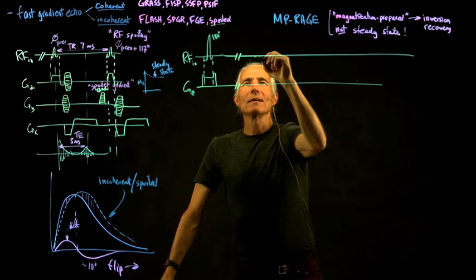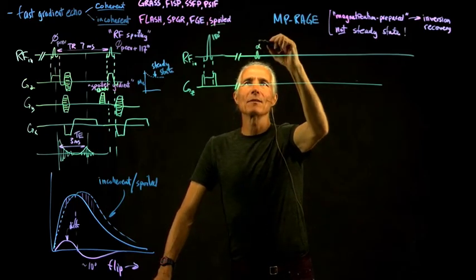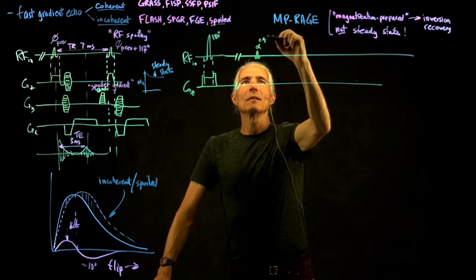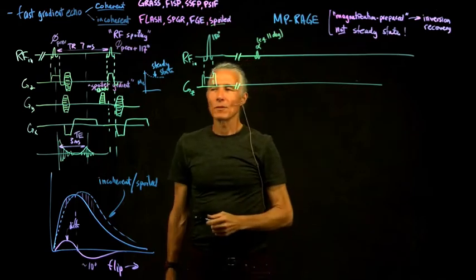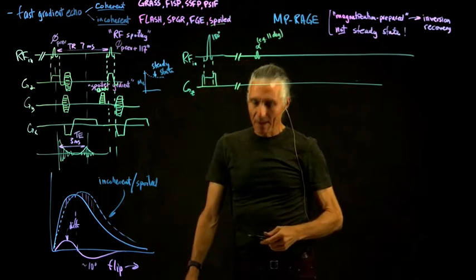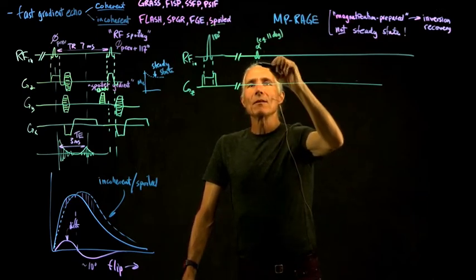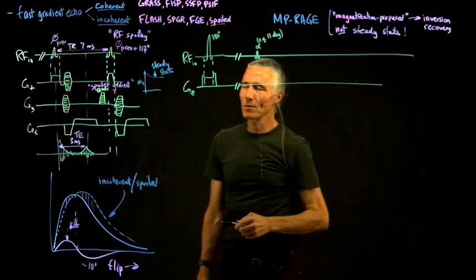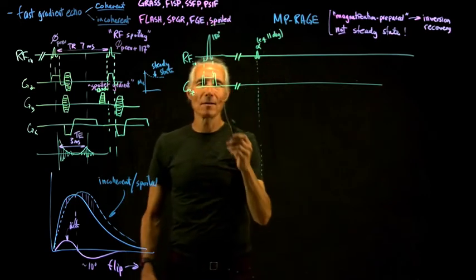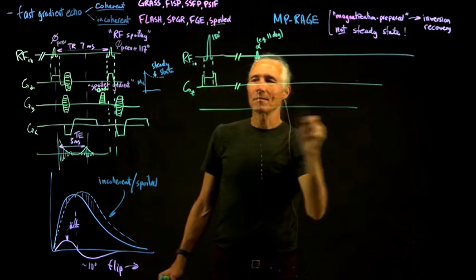That looks like we do a small echo. So here's an alpha pulse, a small flip angle. Instead of 180, this would be, for example, 11 degrees, a much smaller flip angle. We could often just do that one as a little hard pulse. We're trying to save time, so don't even bother doing a slice select, just a hard pulse. We did a slab select on the inversion pulse. So that would commonly be done.